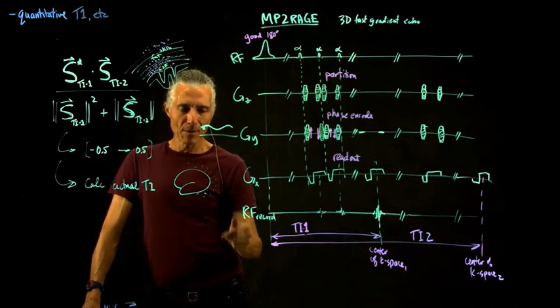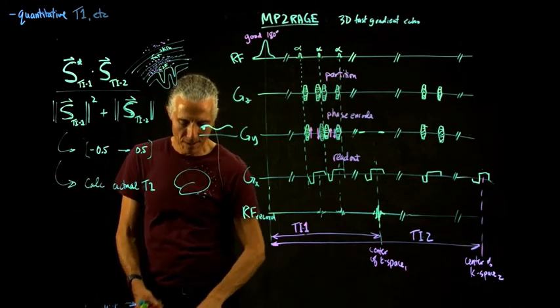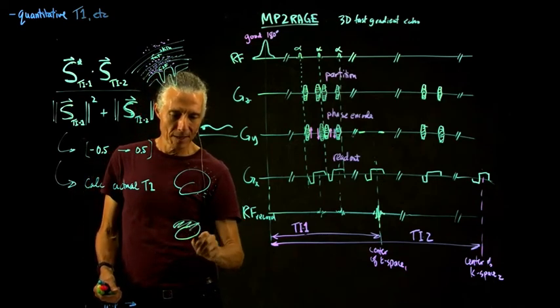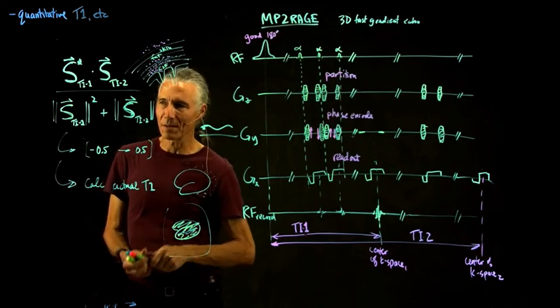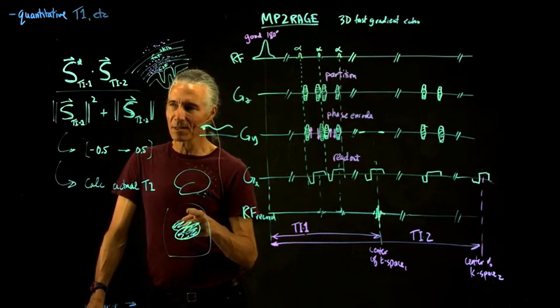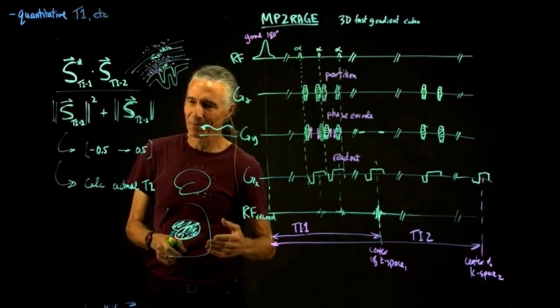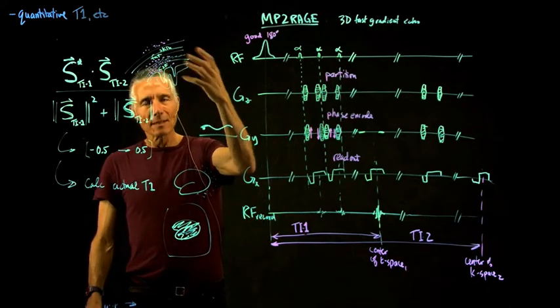Because the number out in the air is very small, since there are not very many protons. In a normal brain image, the brain is bright but the air around it is completely black, because there's no signal. Well, it doesn't mean there's no signal. There's actually a little signal, maybe 1 or 2 or 3, but it's very noisy. And when you take two noisy signals and do something to them, you just get noise instead of black.